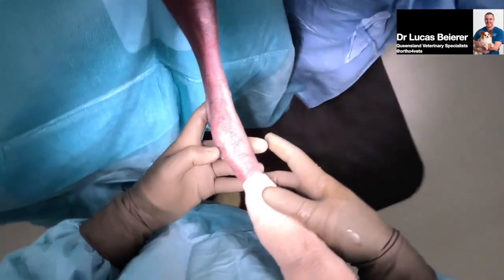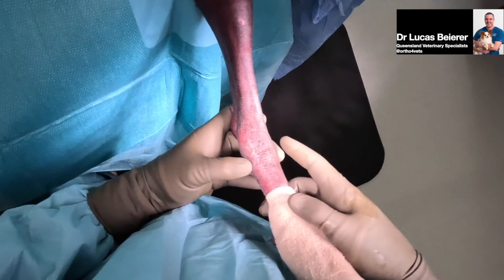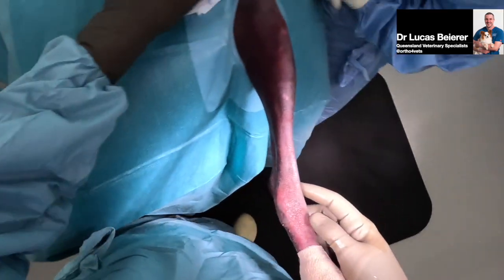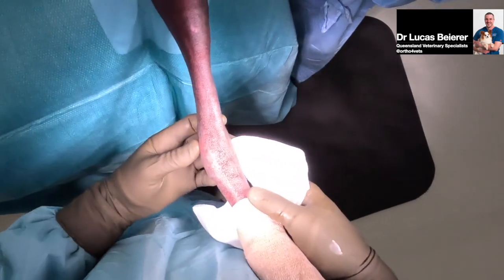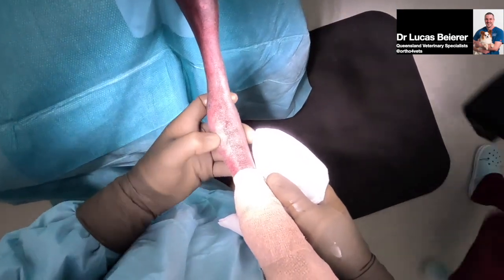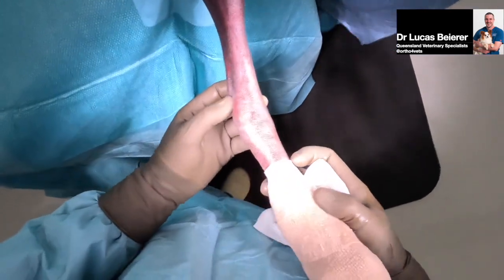This is a middle-aged racing, sort of recently adopted greyhound that broke its hock. Broke its hock running around and has got a comminuted central tarsal bone and sort of calcaneal base fracture. So we're going to begin by doing a medial incision that allows us room to reduce the calcaneal, the central tarsal bone, and then we'll come around laterally and repair the buttress, the whole thing.